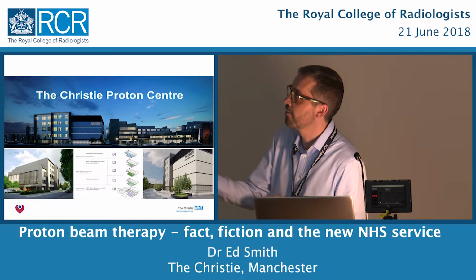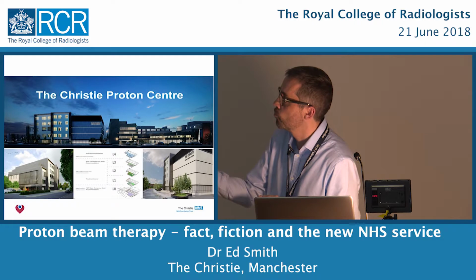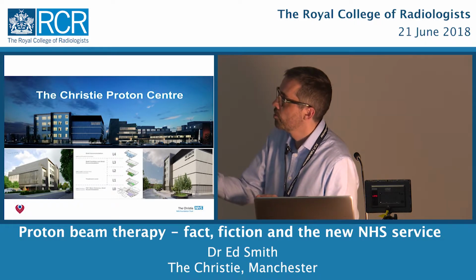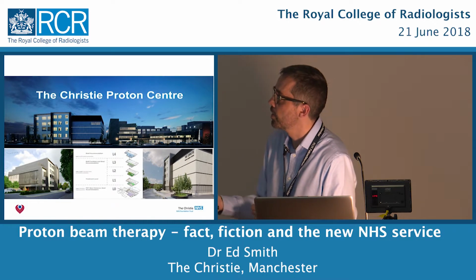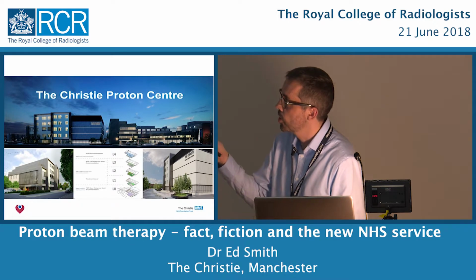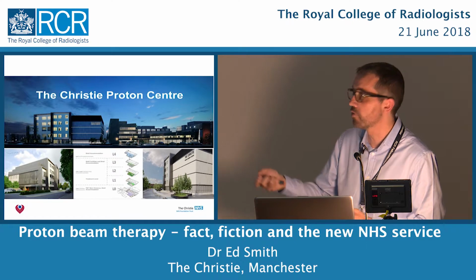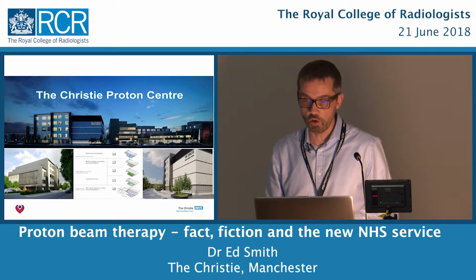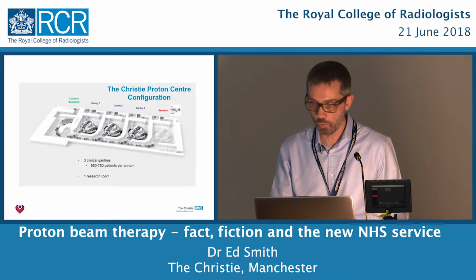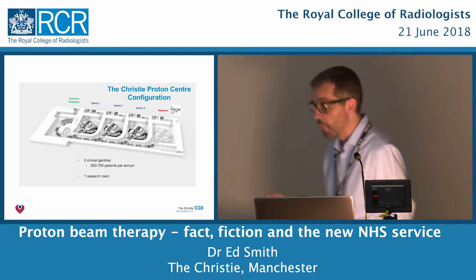But this is the Proton Centre, and this is our Oak Road reception, which has recently been developed. We've got our Oak Road Treatment Centre here, which does chemotherapy, largest phase 1, phase 2 trials unit in Europe, and we've got our investigational procedures unit just there. The Proton Centre is multi-level. Obviously the gantries go over 3 levels, so it just made sense to put our services on a number of levels also. And this is the configuration of the Proton Centre. Our cyclotron is called Emmeline.